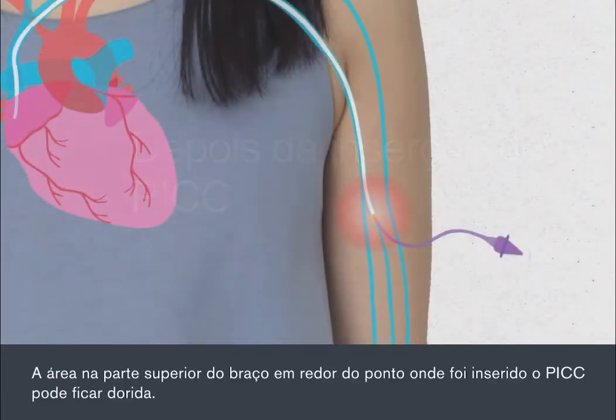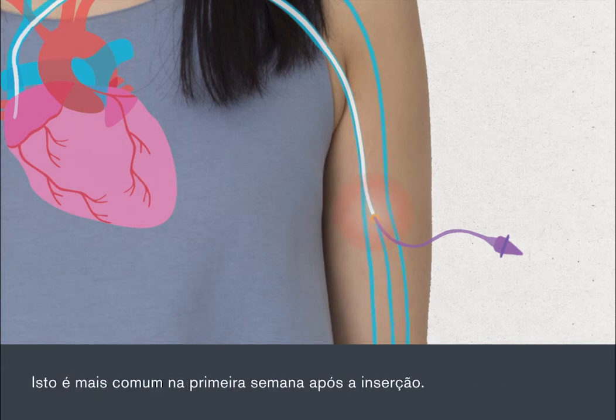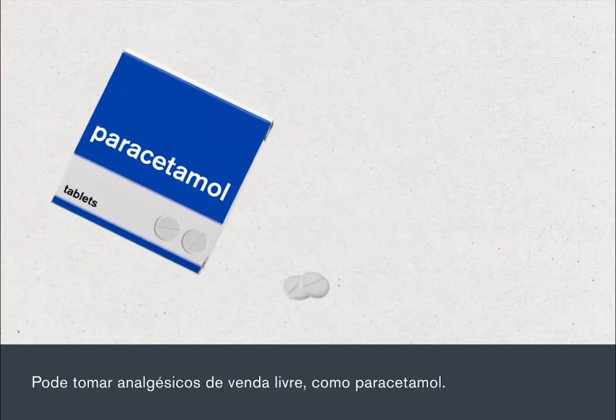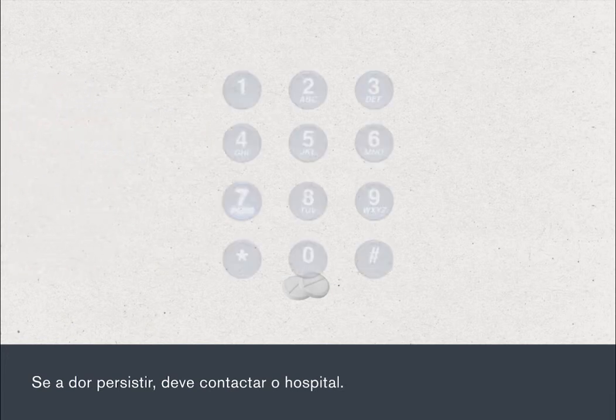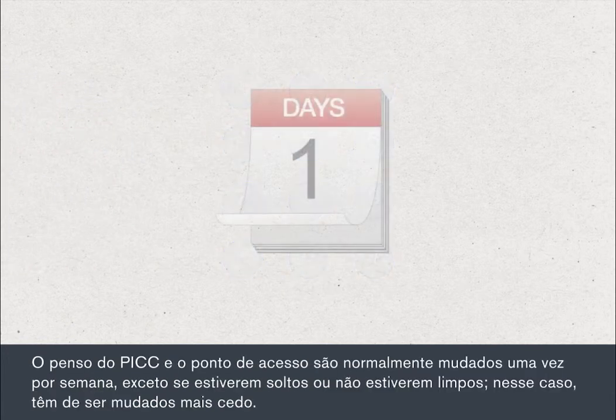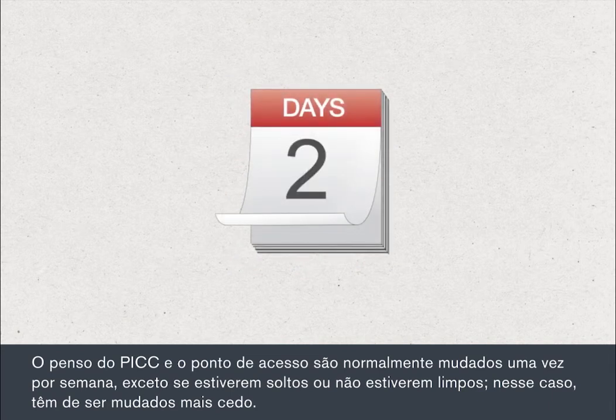You may experience tenderness around the area of your upper arm where the PIC was inserted. This is most common in the first week after the insertion. You can take over-the-counter pain relief, such as paracetamol. If the pain persists, you should contact the hospital. Your PIC dressing and access point are usually changed once a week unless they're loose or can't be kept clean, in which case they'll need to be changed sooner.